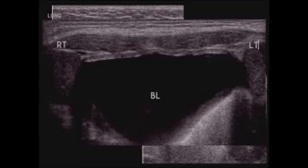So in summary, most of the time, this is all we're going to do to really look for undescended testes, so the inguinal canal and around the bladder. Beyond that, ultrasound has a pretty limited role in looking for undescended testes elsewhere within the abdomen.